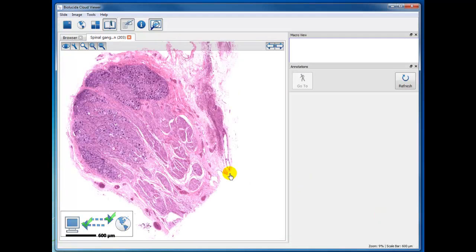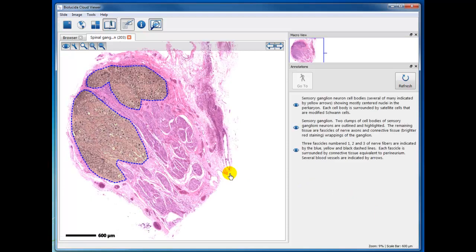Okay, so I'm going to switch over to the other specimen now, which is a sensory ganglion, and these are located along the spinal cord, and they're part of each of the spinal nerves, and it's the sensory component, because each spinal nerve has a sensory and motor root, which join together to form a spinal nerve that then goes out and innervates the skeletal muscle of the body all over the body, but also receives and transmits touch and feel and heat and cold and things from all of our skin, etc.